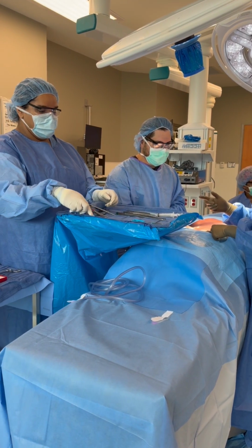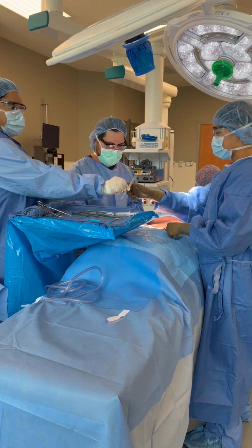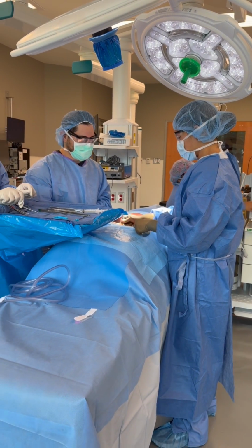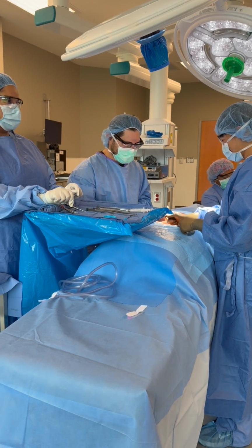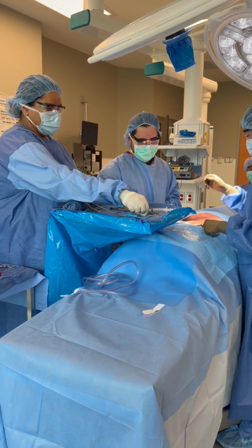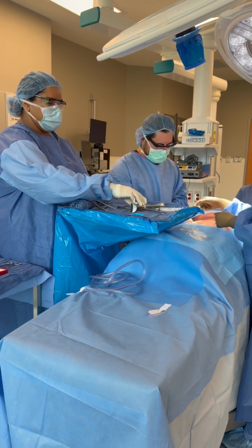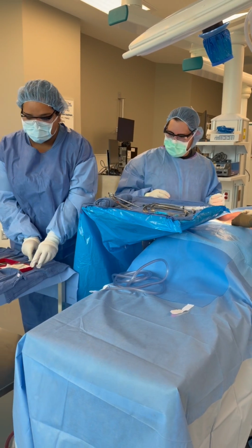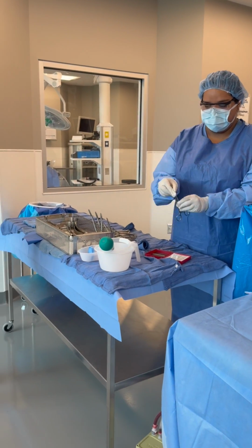Have the knife. Okay, we're done. All right. There we go. There you go. All right, what's the tip? Can you please do it on? I'll give you the suture, please.